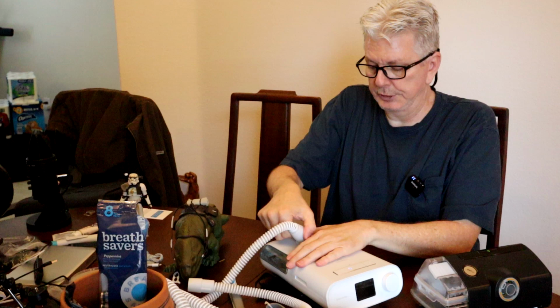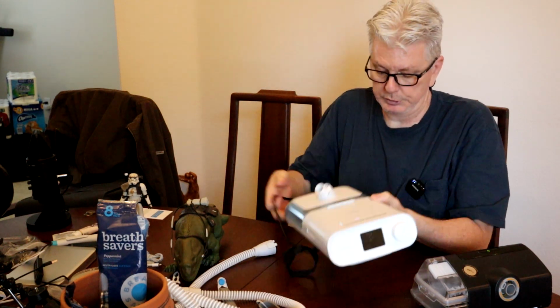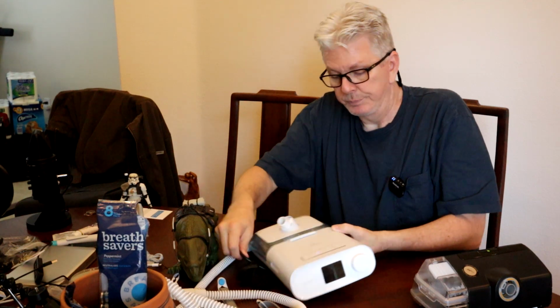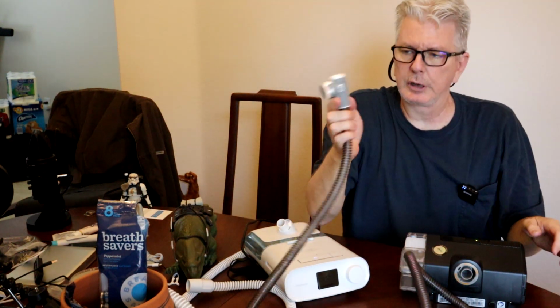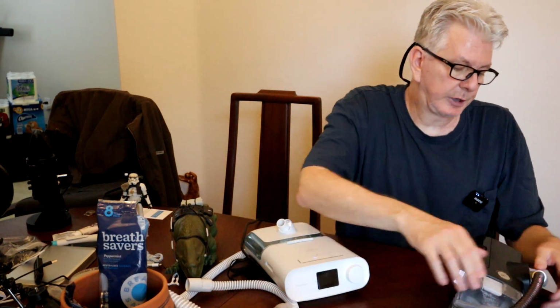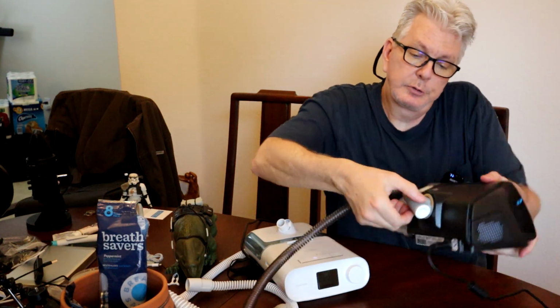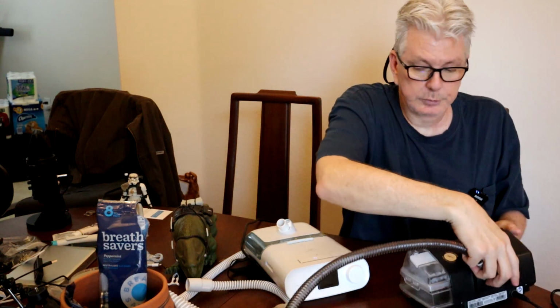If you have the standard tubing, you still put it in the same place, but it doesn't snap in there. It's got that rubber end on it. You just put it on there, and it works just the same way, except it's not heated. The ResMed has, you know what? I honestly don't know if they just have standard tubing. The only tubing I have for the ResMed is the heated tubing. And you put it in like this. I'm sure they do have just standard tubing, but I haven't used it. You just plug it in, and to take it out, you squeeze and release like that. No big deal. So we do that.